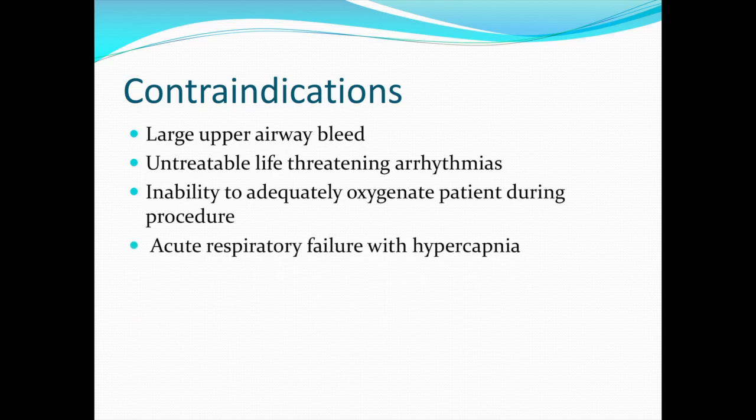The same can be said about a patient who's in acute respiratory failure with hypercapnia. This should first be corrected, if possible, using a ventilator, and then once the PO2 and the PCO2 have been normalized, the procedure can be reattempted.